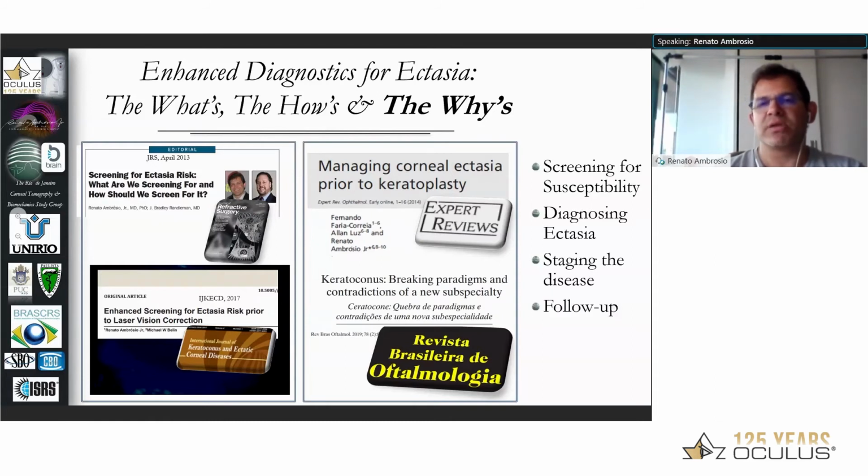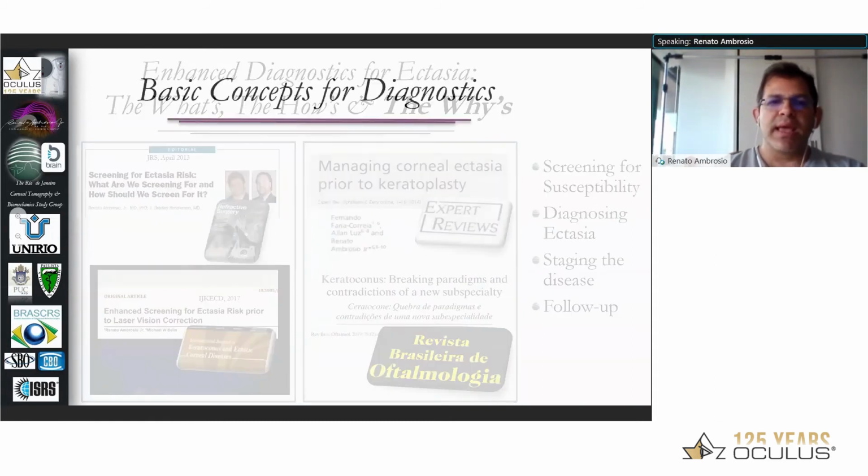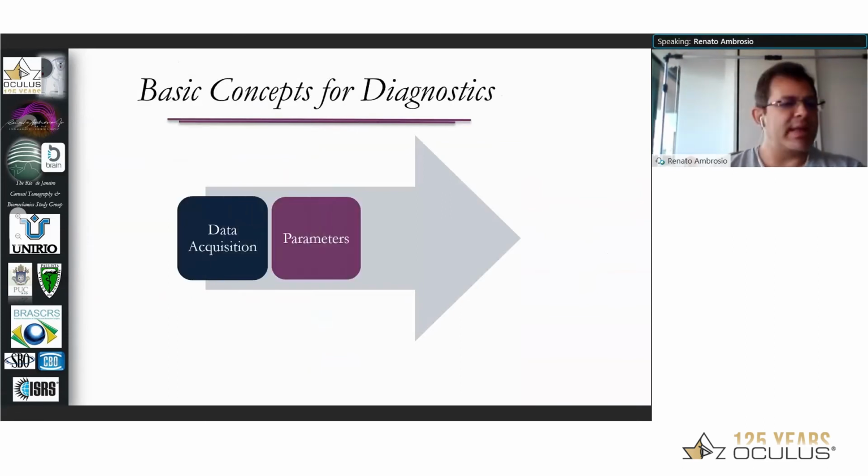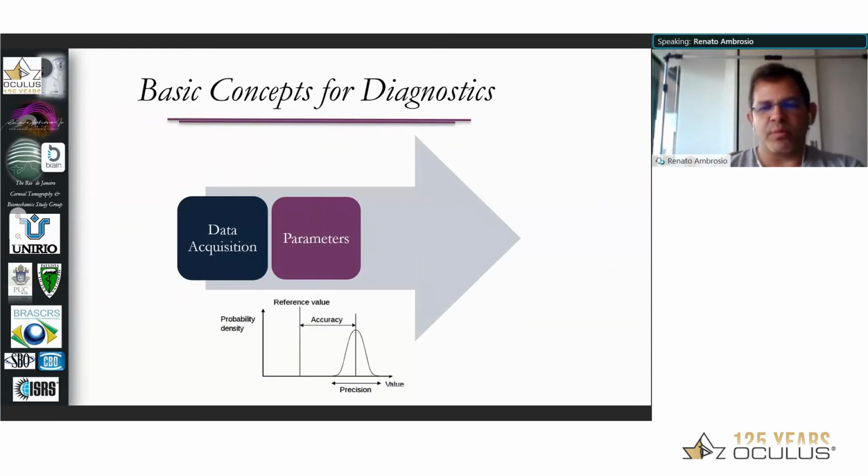But these are the whys that we need the data. Basic concepts for screening are very important. We have data acquisition and then parameters. Michael made a beautiful point on his display: look at the precision.